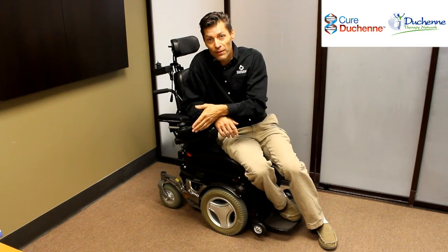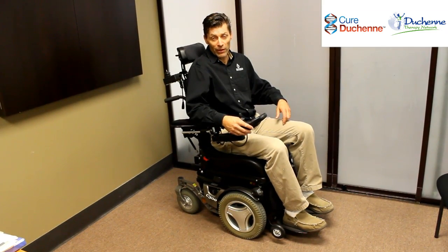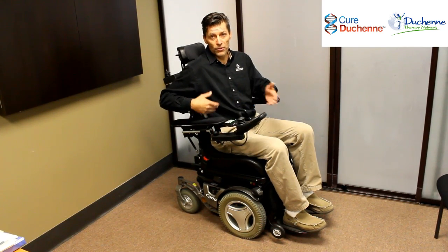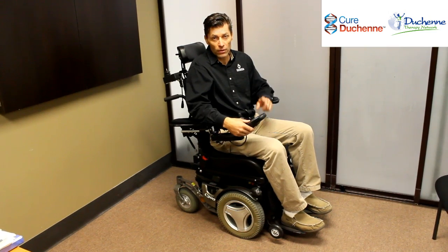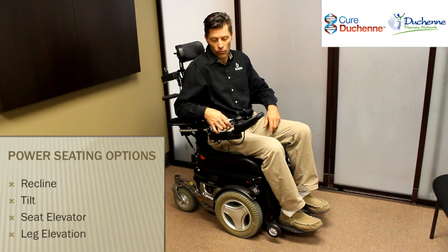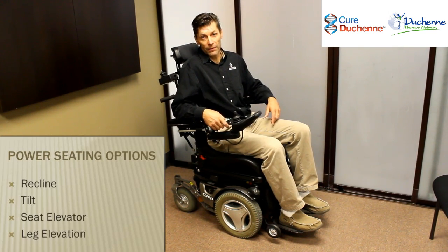Once you pick a drive configuration, then look at the different manufacturers and see which one really appeals best to you. The next aspect of power wheelchairs we're going to talk about is the powered seating functions and what features and functions you might want to have on your own chair. So let's just talk through a few of the things that a powered seat can do. One of those features is a power adjustable back angle, or power recline.